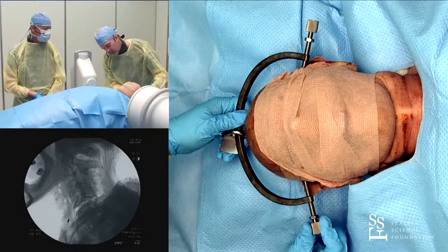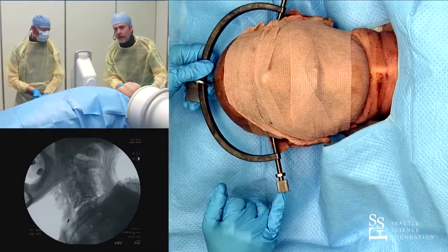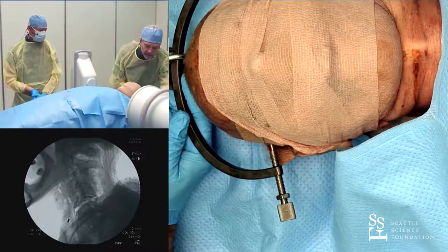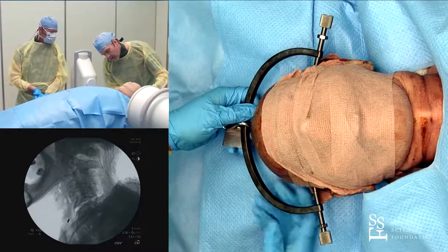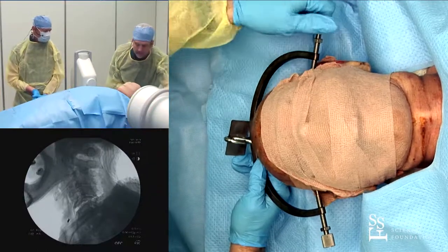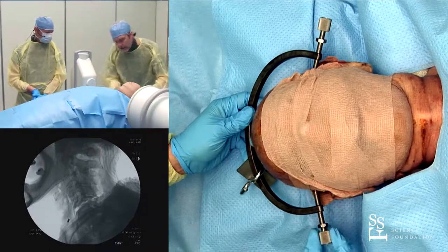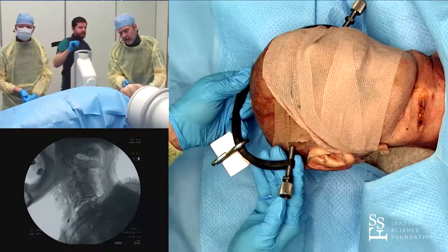Now I'm tightening this down and starting to feel some resistance, so I'm looking for the indicator pin. The indicator pin is on the patient's right side and has not yet popped. I'll keep tightening — a couple of turns on either side. And here we go — starting to see it come out. There we go. Now the indicator pin is out, as you can see here.